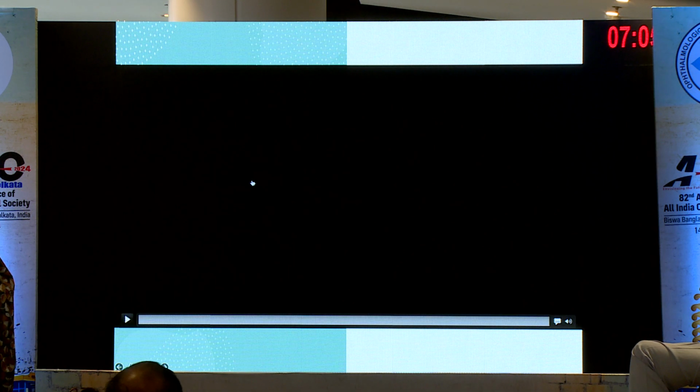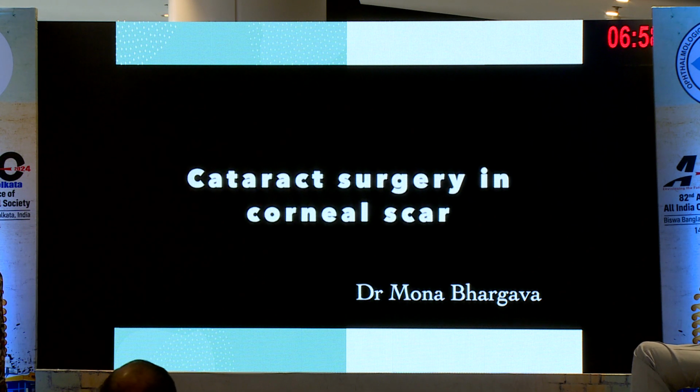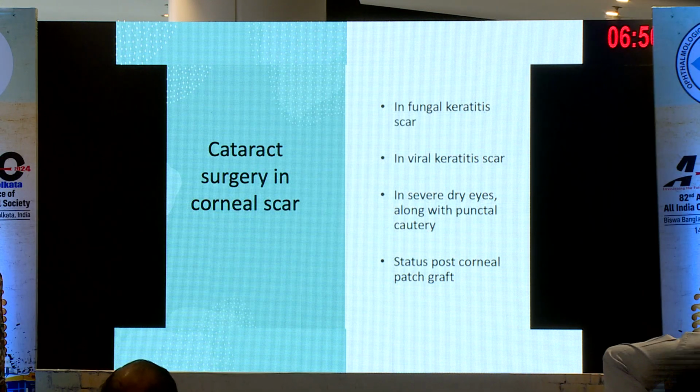This is a short video. This is cataract surgery in corneal scar. So I'll be covering the following case scenarios in my video.